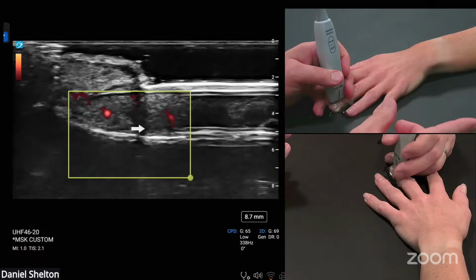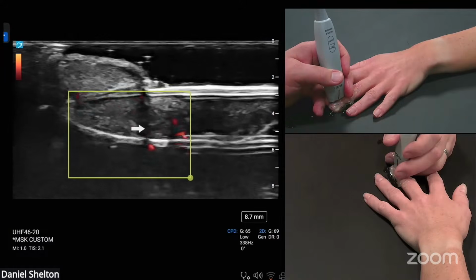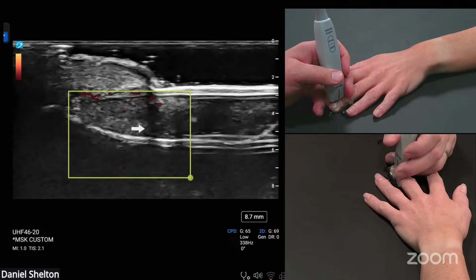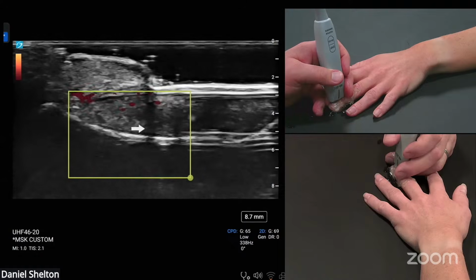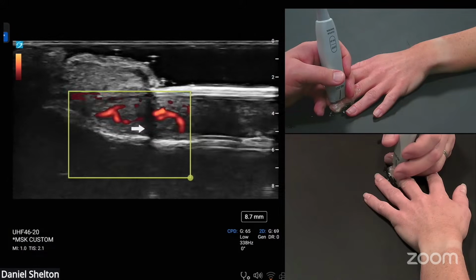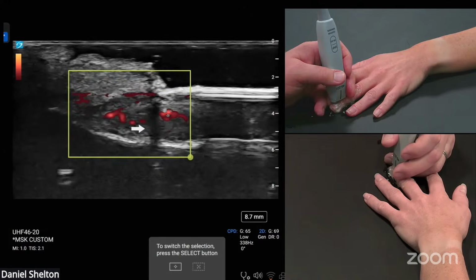And that same thing can happen here with color. So that's when you want to go through your scales, because everybody has a different velocity, everybody has different blood pressure, everybody has different properties to their blood. So that can also affect things like temperature in the room. It can also make a big difference when you're scanning things with low flow.